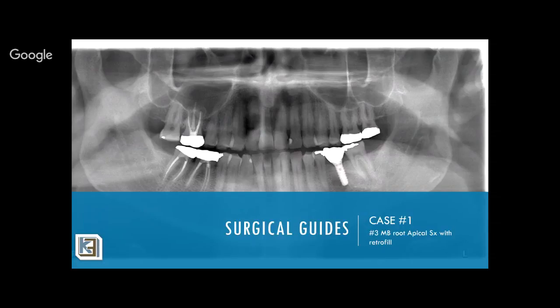Otherwise, if you use a small field to create your guide, it's still accurate, but there's a higher chance of losing your accuracy with the cant because you don't have bilateral accuracy from the other sides on your guide. And as you go deeper, it may affect your accuracy and staying centered on your path. So smaller field, high definition, higher kVp, but you're going to need one for planning and one to create the guide.